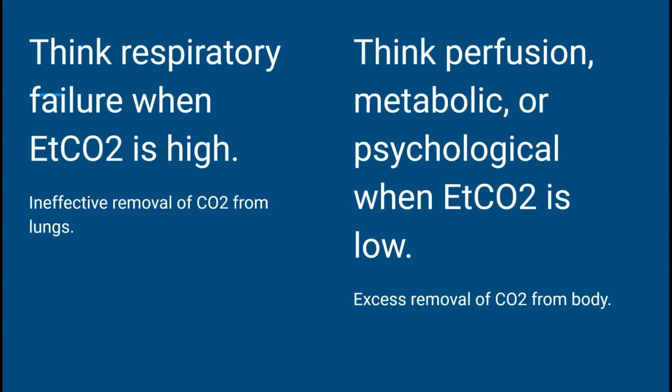So if you have a high end tidal, your first thought should be that there's some sort of respiratory failure, right? The lungs are not working well. There's air trapping, or you're not breathing at all, but the perfusion is still good. If the end tidal is low, the perfusion is not good, right?